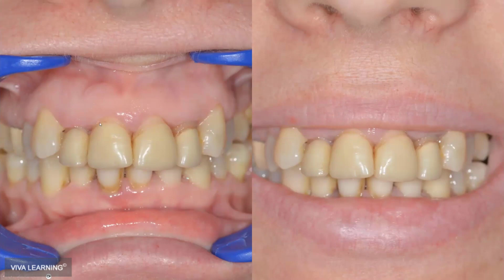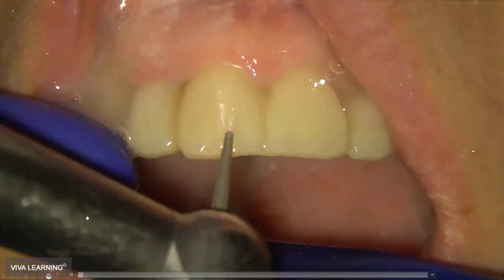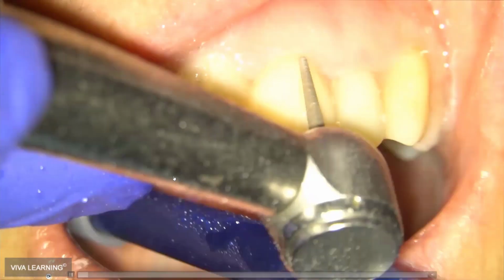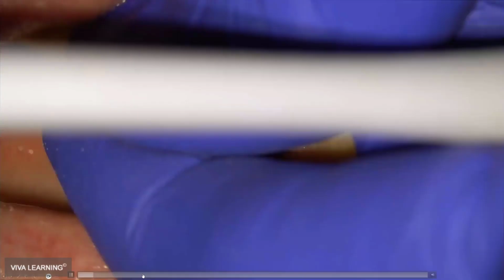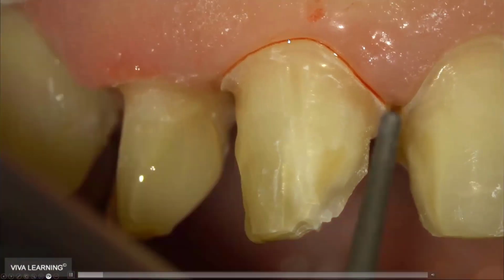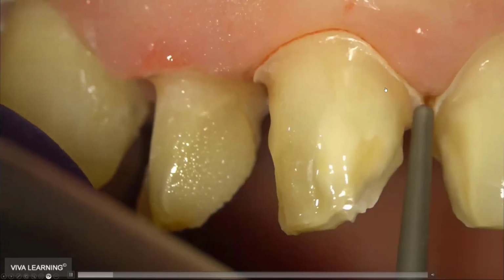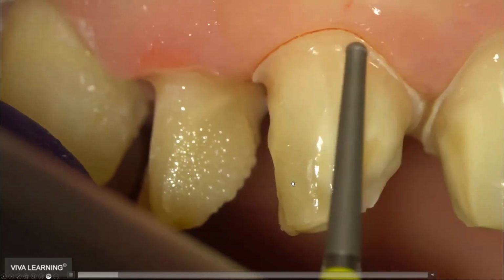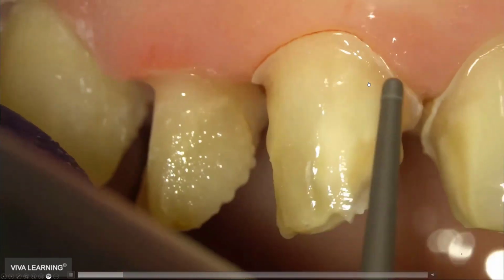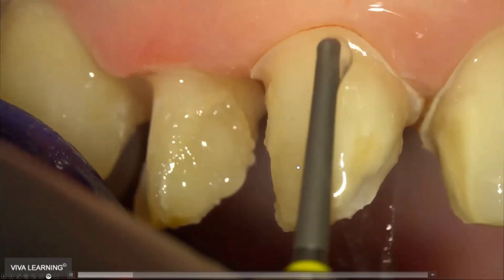So in this case, we need to make a provisional mock-up to test the new smile. And at the preparation appointment, we need to remove the mock-up. We do this with very fine burrs, not to change a lot of the preparation, and then with the fine red and yellow burrs, we decide to place the margin on the central incisor just at the level of the tissue.